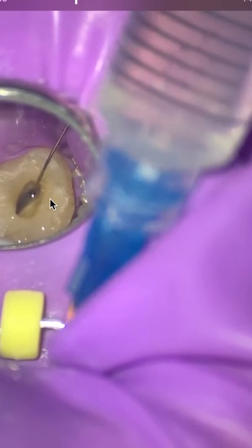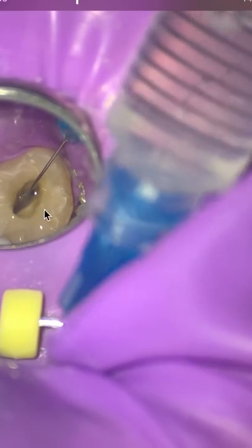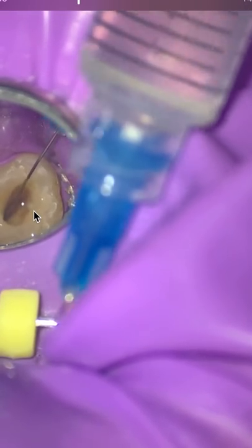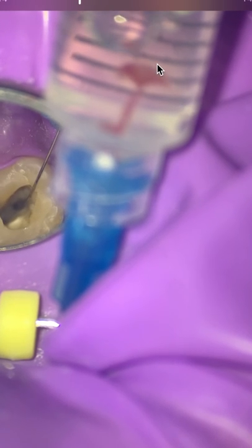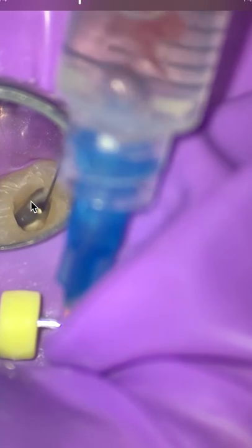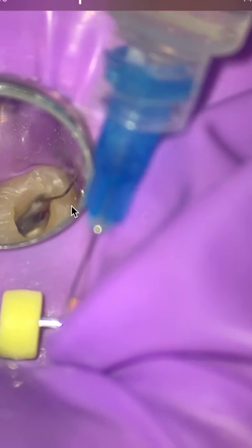The first thing I'm going to do is make sure that I debride the apical portion and remove all the pulpal tissue with my medium, my 3506. You can see it's still bleeding. To me, I still don't know if it's excess pulpal tissue at the apical third. I'm hoping it is, because if I debride the canal, look at that, I just aspirated. I don't do this very often because I don't like to get a lot of bleeds from the chamber, but from the canal. I'm aspirating my hemorrhage.